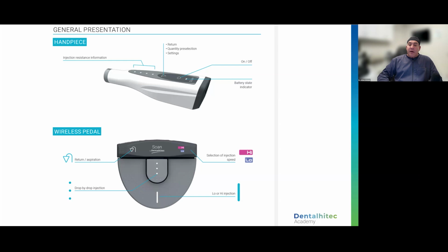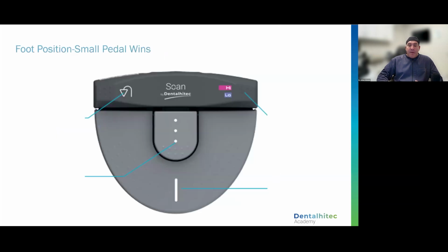If you're using the 16 millimeter needle and giving a block, I don't think I've ever done that with these units, but it does have that button on the upper left that you can do some aspiration. You just need to make sure you've already given an eighth of a carpule, okay?